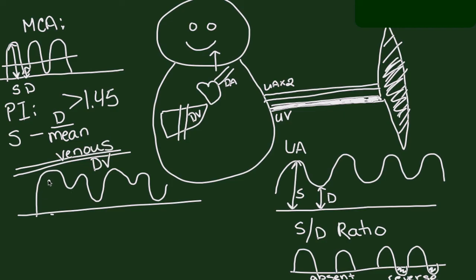So again here, this is systole of the ventricle, this is diastole of the ventricle and early atrial systole, and then you have systole for the atria here. This is usually called the little A. So again, as long as you see normal flow in this atria with atrial kick, A wave, this little A wave, above the baseline with forward flow like you would have here, then that's a baby with normal resistance in that ductus venosus.